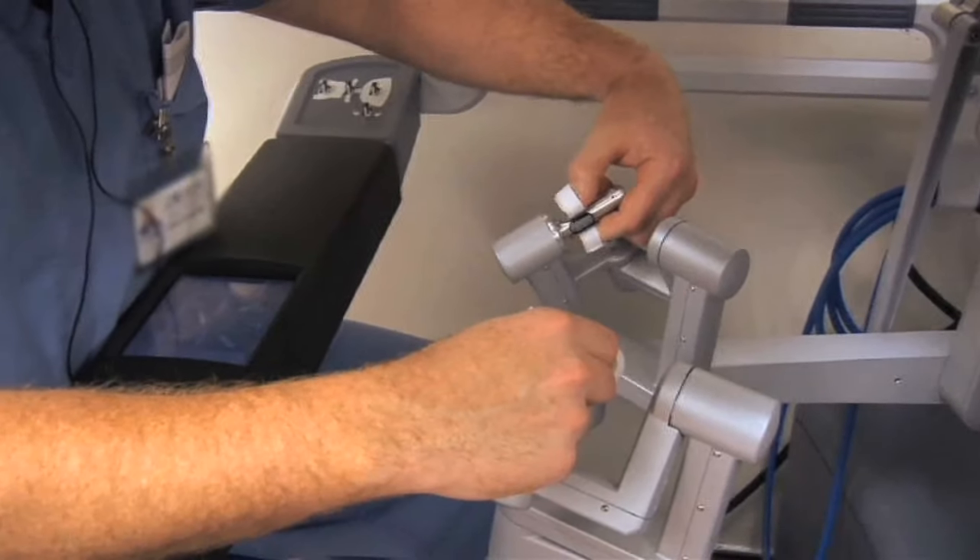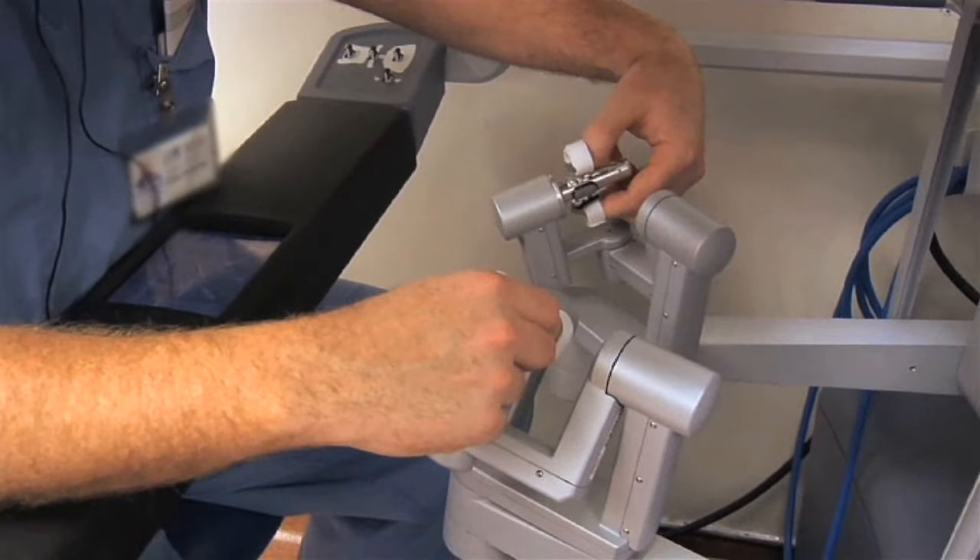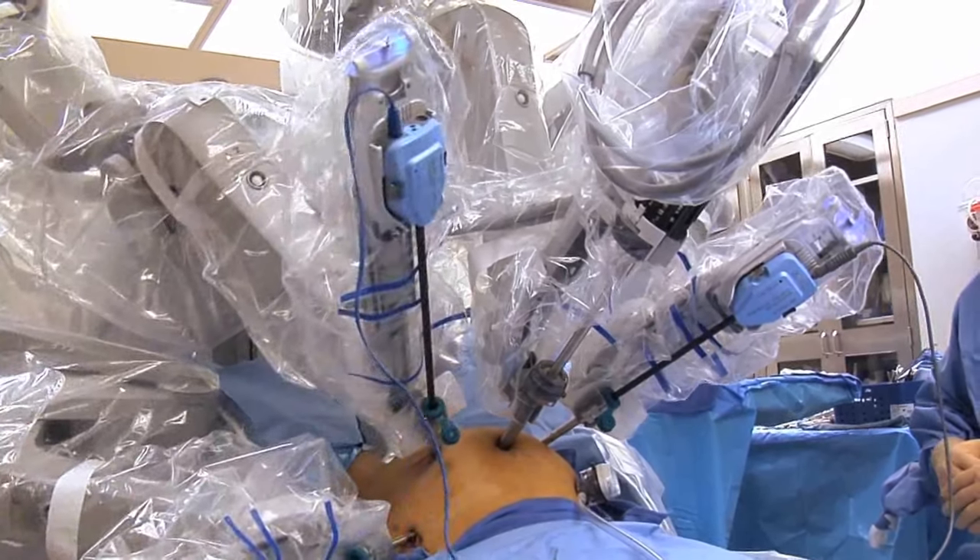One thing that's unique to robotic colon surgery specifically is you need to get the specimen out somehow. That involves a small incision that's usually only about one to two inches in length, placed either around the belly button or down in the area where a C-section incision might be. What's special about robotic surgery is that even compared to laparoscopic surgery, that incision is much smaller than it would be otherwise.